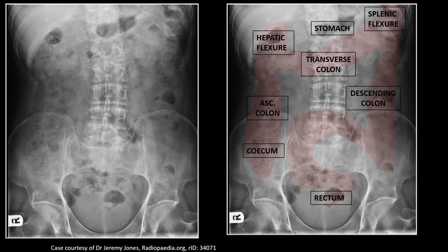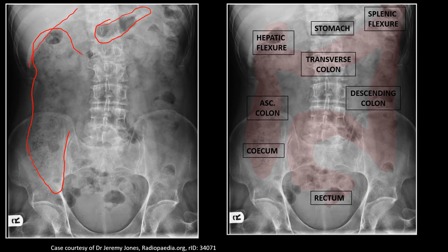In this image, we will try to identify gastrointestinal organs in the supine position. Here we can identify the stomach, the cecum, and ascending colon. Here is the hepatic flexure of the colon — you can also identify the lower border of the liver here. This is the transverse colon. This is the splenic flexure of the colon. This is the descending colon, and this part is the rectum. This is the sigmoid colon.